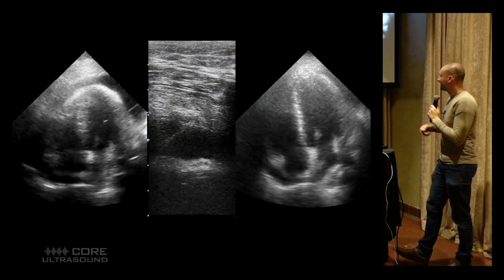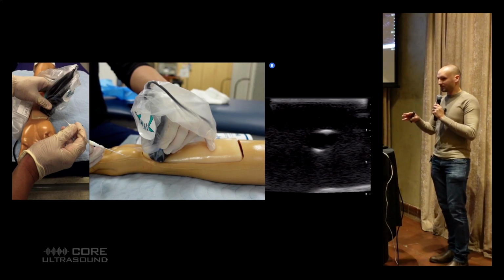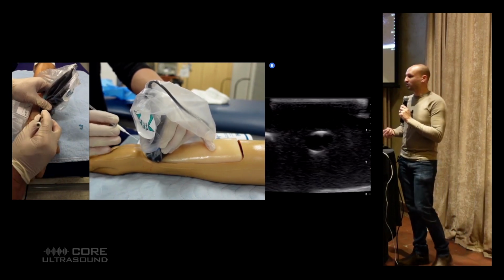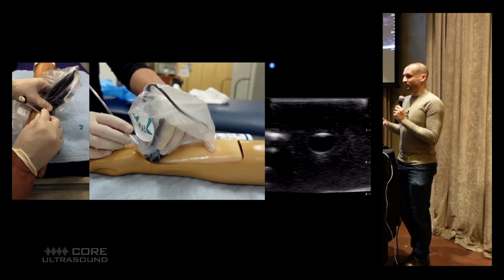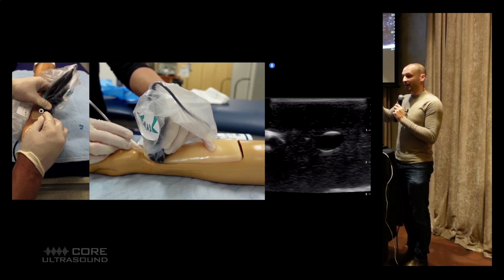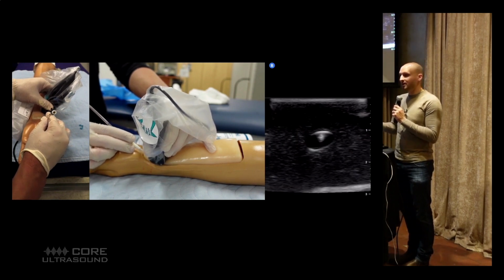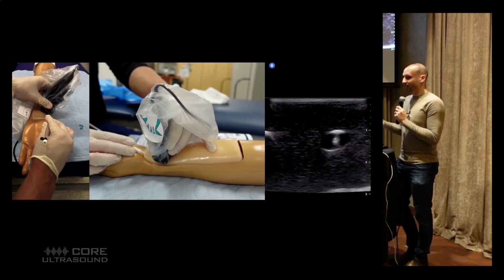It works really well. Now, one of the things I like doing, I know this is like an echo one, but I just want to make sure to mention that in arrests, I love putting art lines in all of my arrest patients because we're so bad at pulse checks. We are horrible at identifying if somebody has a pulse or not. I'm talking medical professionals. I've done studies on this. We do not do a good job. So in all my arrest patients, I like putting art lines because it doesn't matter what the pulse is. If that diastolic blood pressure is greater than 40 with an art line, the patient is perfusing enough, right? So you don't have to even do pulse checks if you get that art line in.